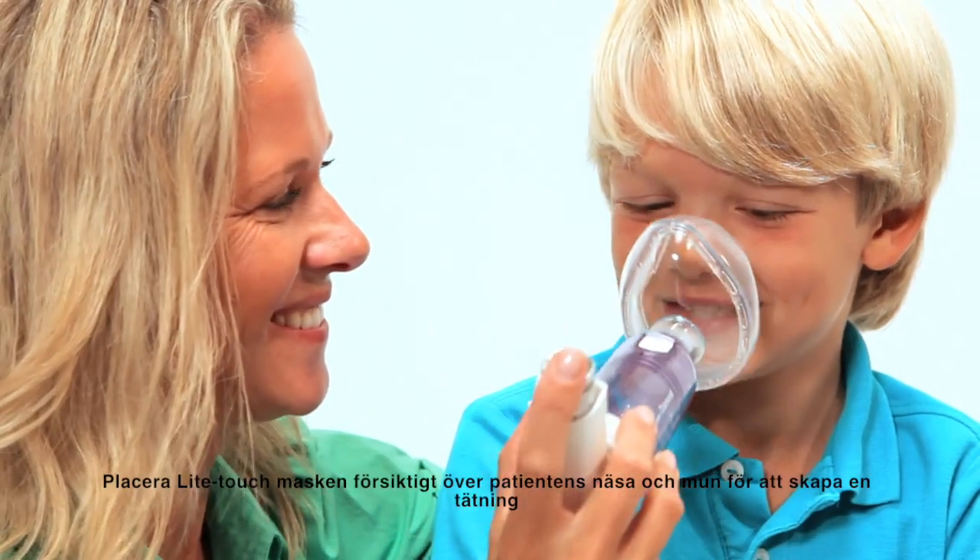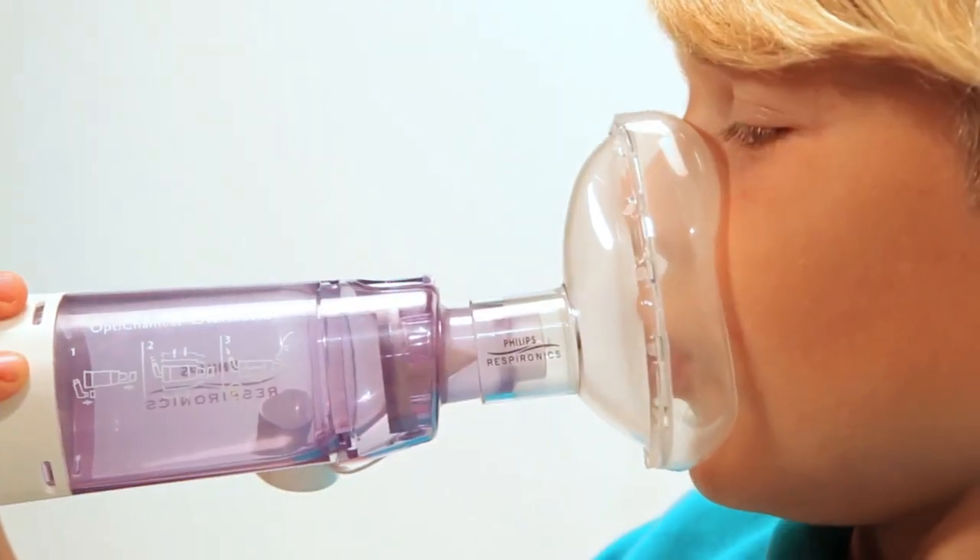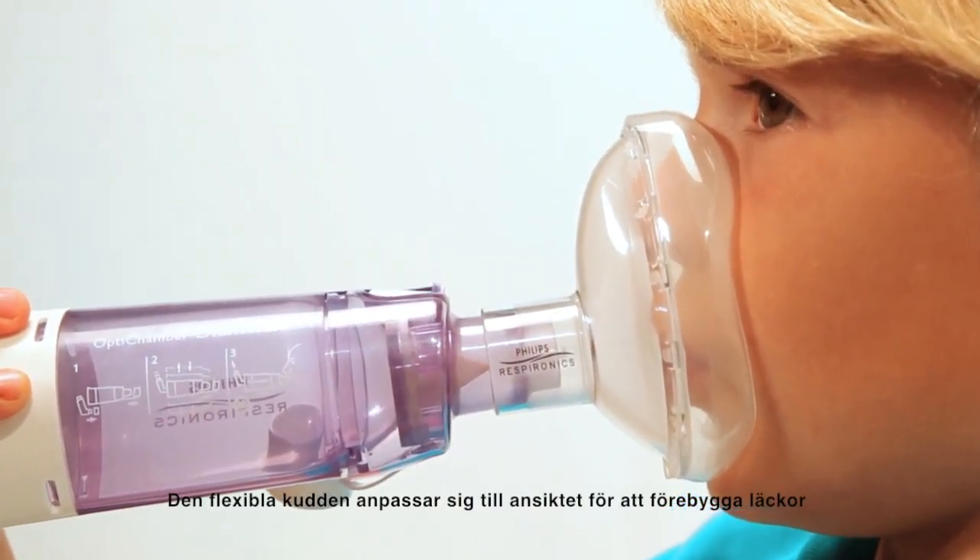Place the Light Touch Mask gently over the patient's nose and mouth to create a seal. The flexible cushion contours to the face to prevent leaks.